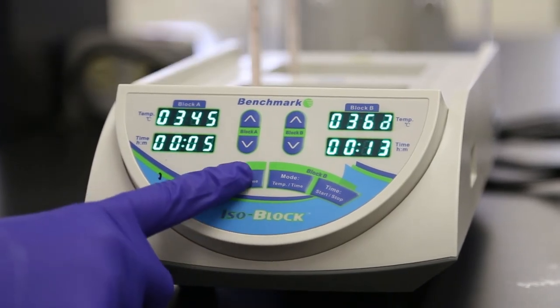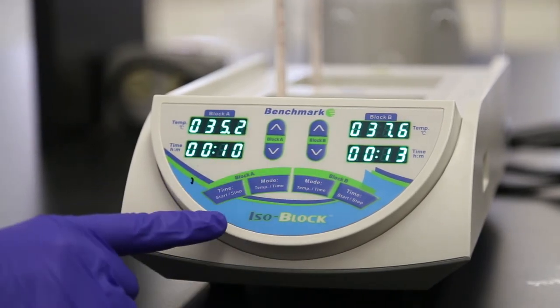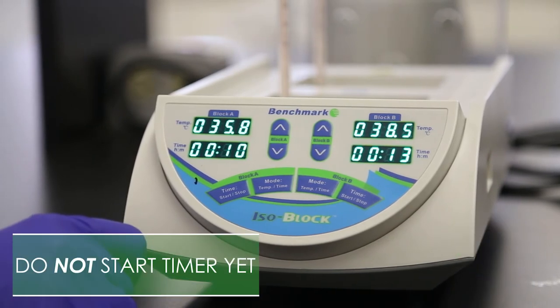To use the built-in timer, press MODE-TEMP-TIME for block A twice to select the time setting for block A. The last digit of the selected setting will flash. Note, the display includes hours and minutes. Using the block A arrow keys, press and hold the up or down to set the timer to 10 minutes. Don't start the timer yet.